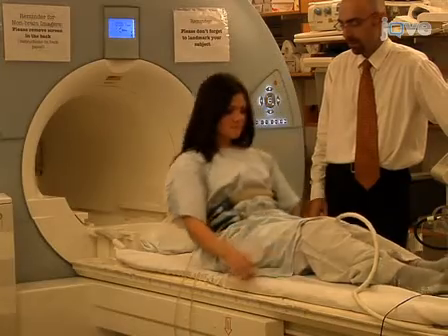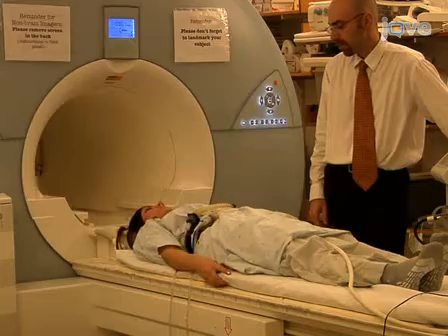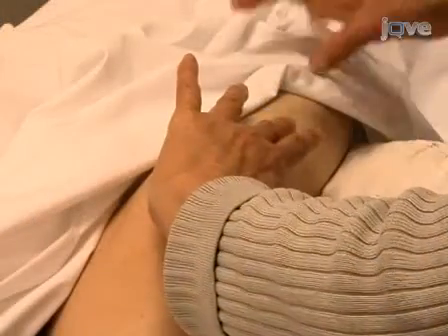I'm Kathleen Hui from the Martino Center in the Department of Radiology at Massachusetts General Hospital and Harvard Medical School. Today, we will show you a procedure for functional magnetic resonance imaging during acupuncture stimulation.